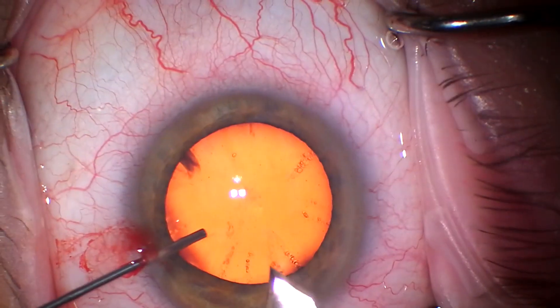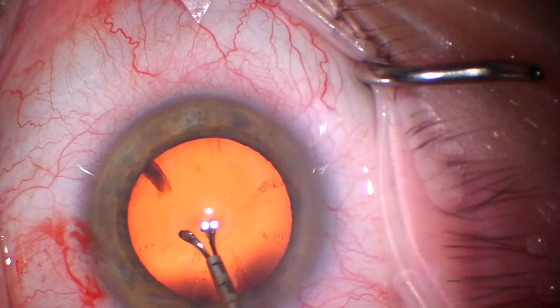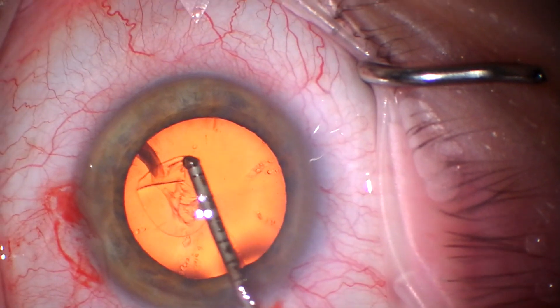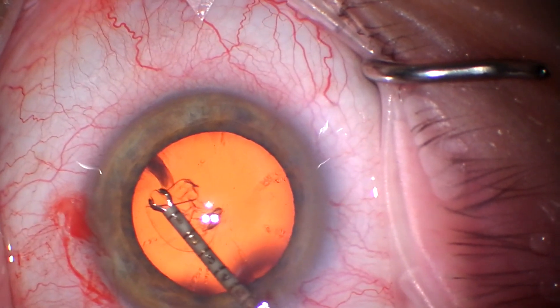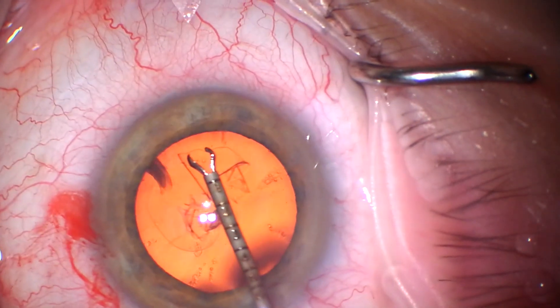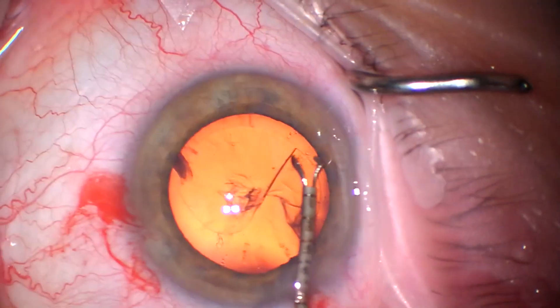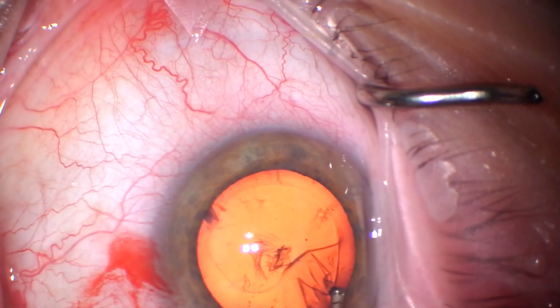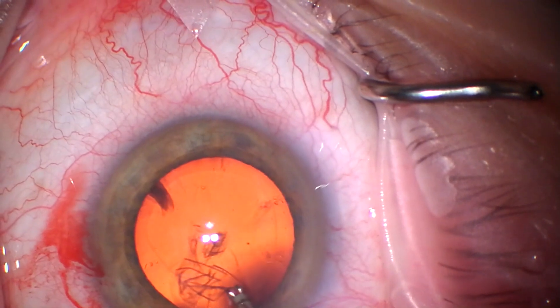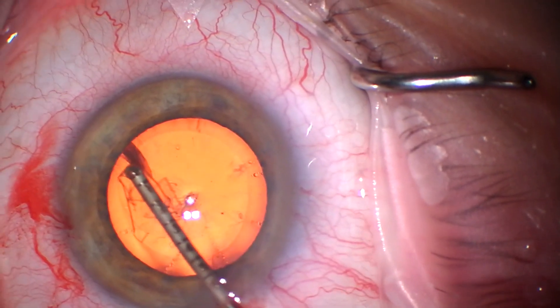A 2.2 diamond from Mastel is the best incision I think that can be made for lenses that still have good optics. This is a capsulorhexis attachment to an MST handle and we're just completing a well-sized rhexis here for this relatively large previously highly myopic eye.